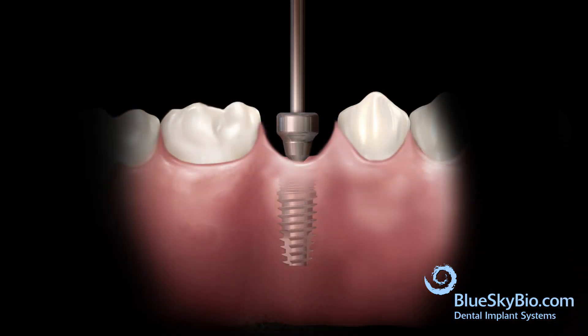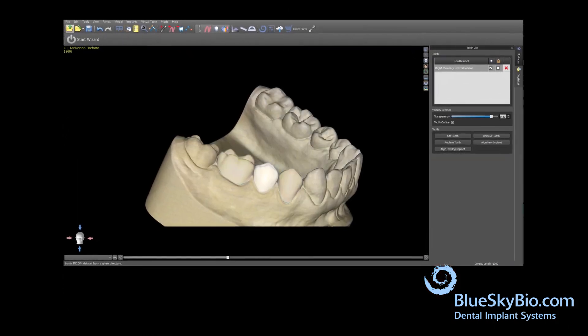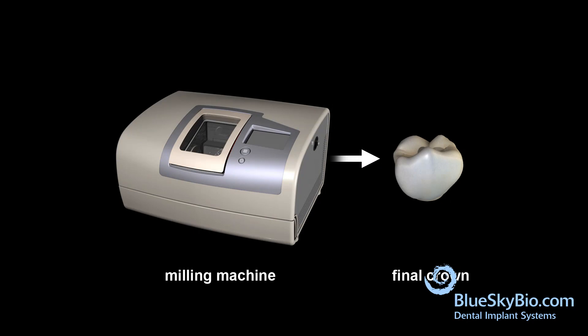Replace the healing abutment. The restoration is designed in a CAD-CAM program and manufactured by either printing or milling.